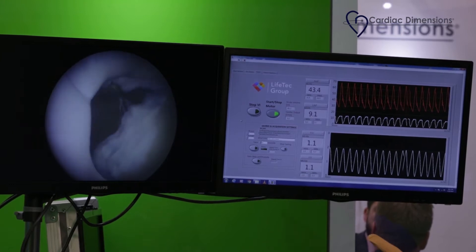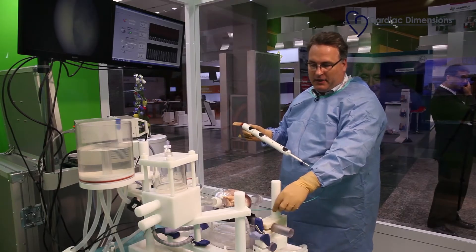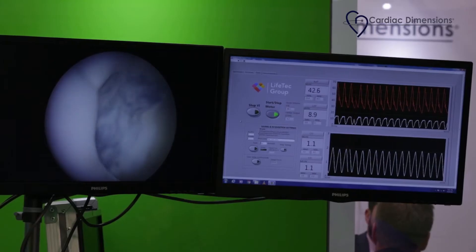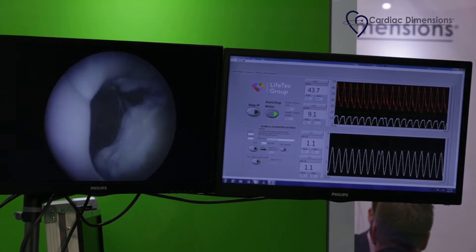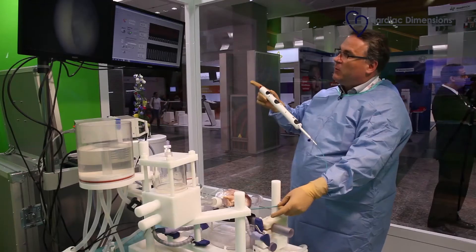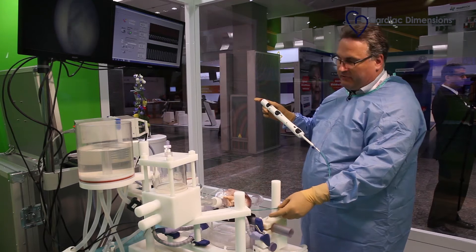Here we see the effect of the tensioning of the mitral annulus dynamically by coronary sinus device. We see the reduction of the left atrial pressure, and I now will give way in order to release tension here, and we'll see the valve opening and the LA pressure deteriorating.